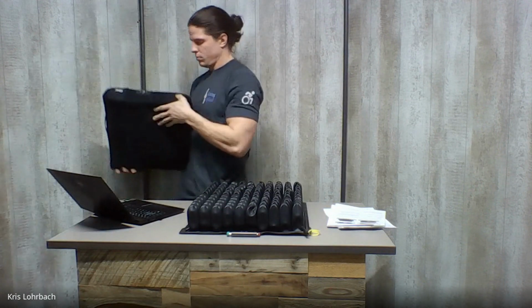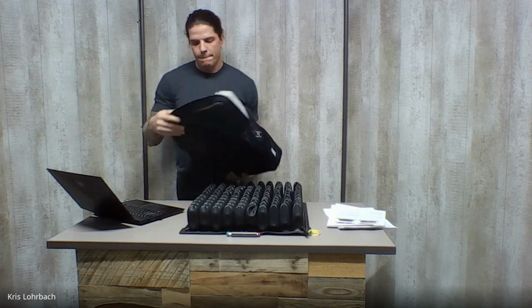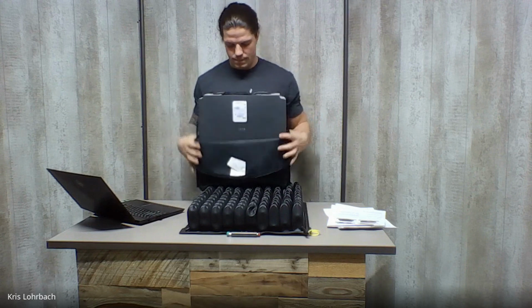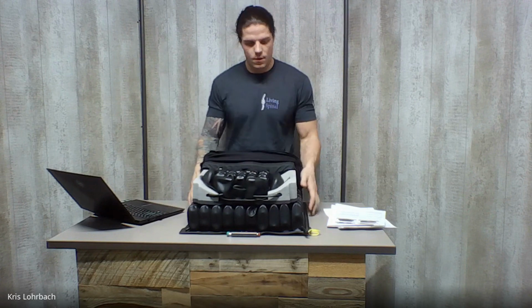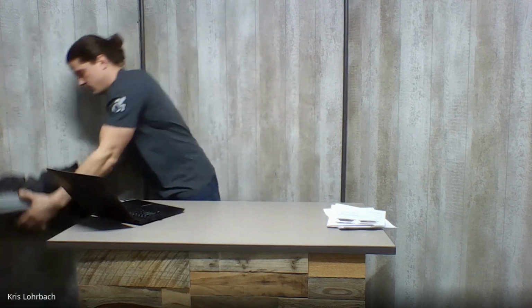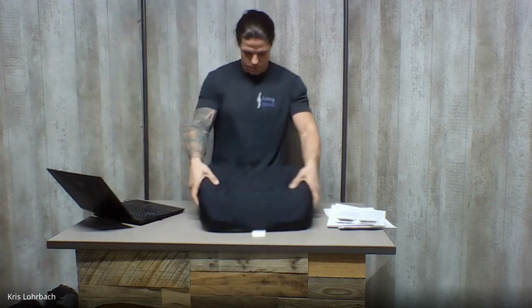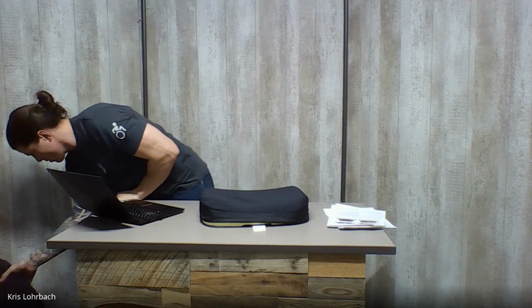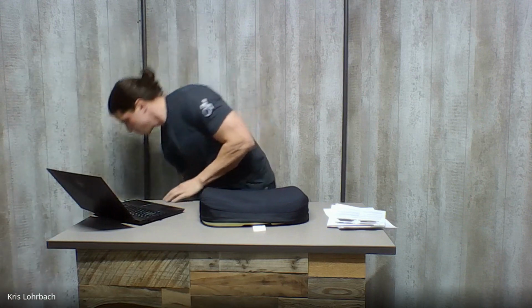There is a possibility that they pop, right? They are air. If someone has cats, it's probably a problem. Seriously, if you have cats with claws, they will pop air cushions, right? So that's something to really know and think, like literally ask, do you have a cat? Before you give them an air cushion, because when they're in bed, their cat's going to jump up on their wheelchair. But the really cool thing is Roho has a patch kit that comes with every single cushion.